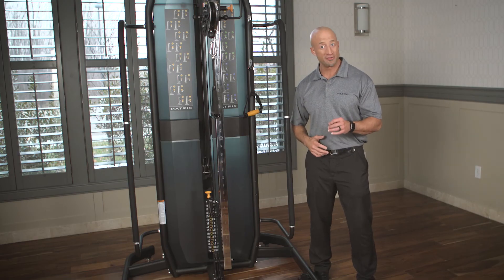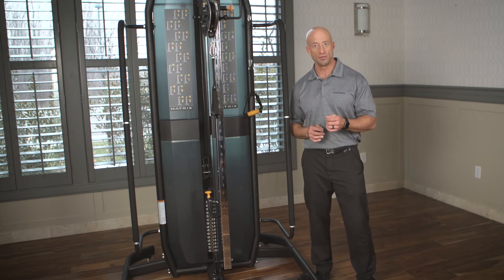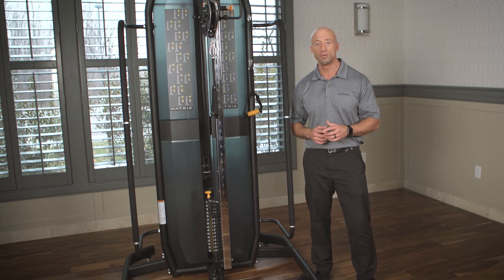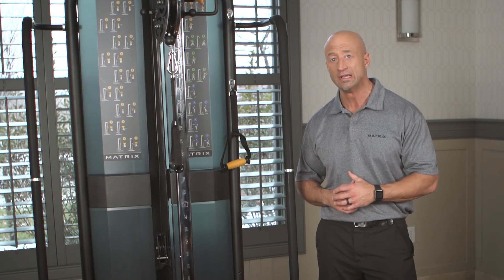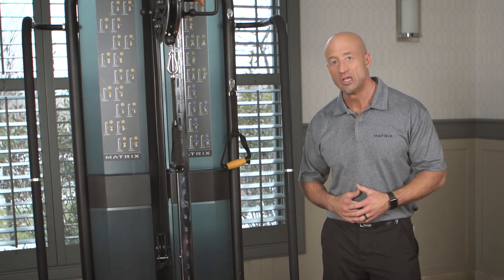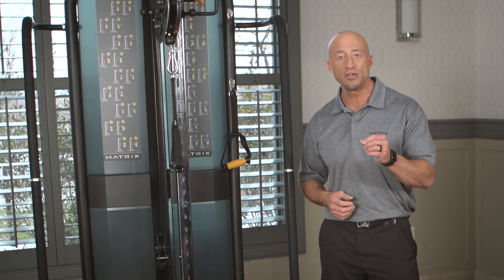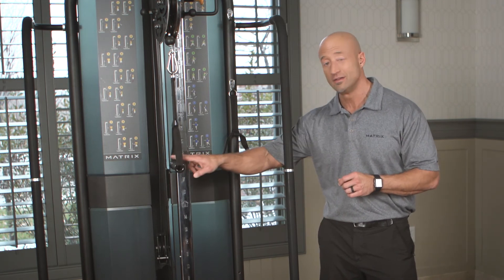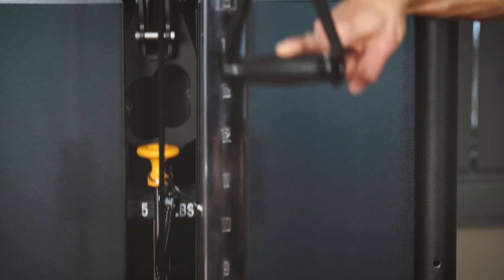An additional unique feature on the product is the very low starting weight. During development we knew that this product would be used in rehab situations where external and internal rotation would be important. Those types of exercise engage small muscles in the shoulder and it's very easy to overload them on typical equipment. So we developed a special head plate that's lighter than the norm, and when you use the one-to-two pulley ratio you start off with a very low weight with just the head plate, so you can do it really easily.